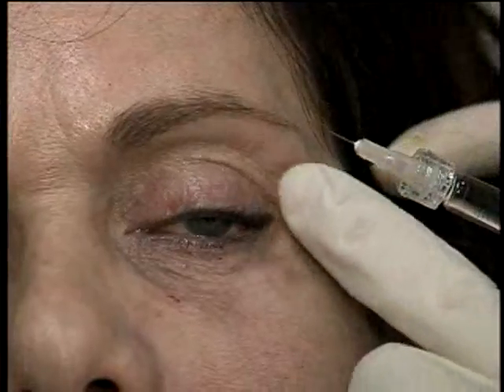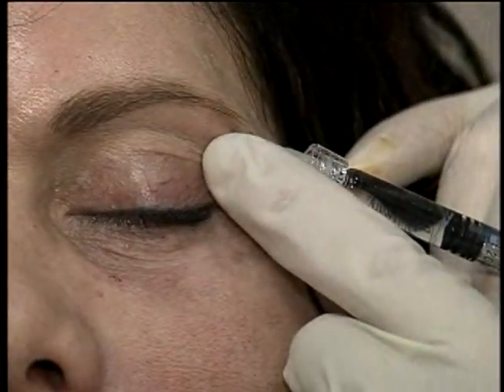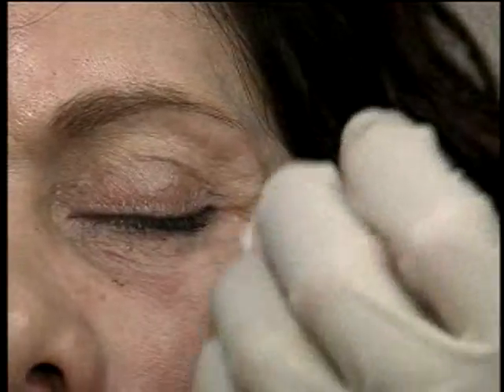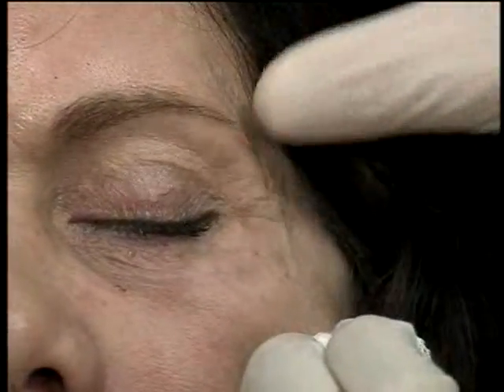You don't require a lot in this area in order to get a nice look. In fact, too much gives a very masculine look. So just under a little bit of the tail of the brow, staying lateral, will give a little lift to the brow.